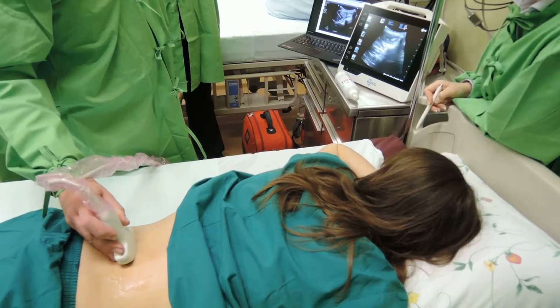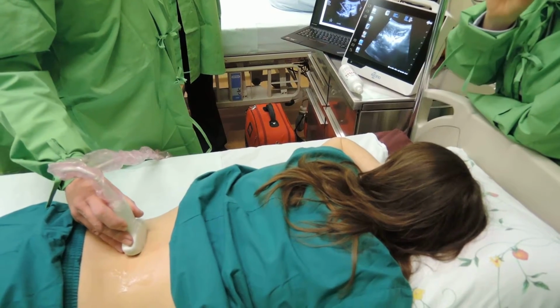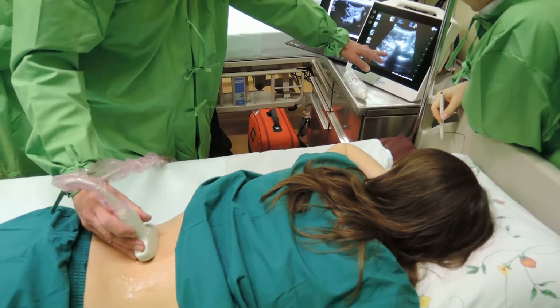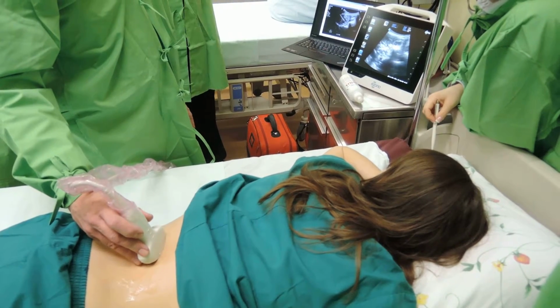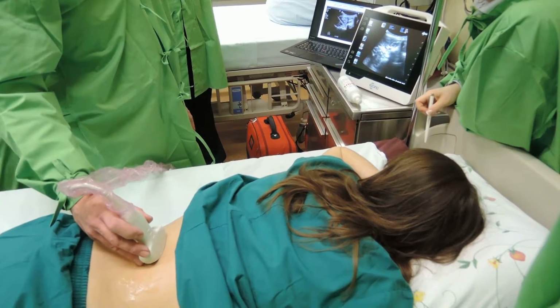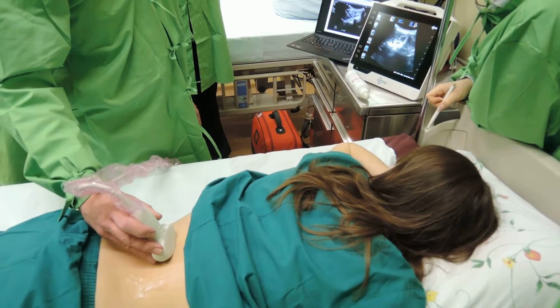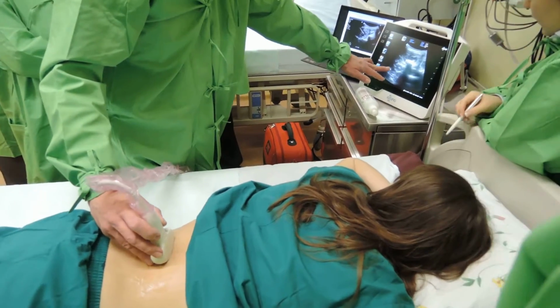This scanning we mainly use for orientation, when we find the midline and the spinous process. No, this is the articular processes. And now one can use it as well to show the origin of the nerves. Next we will try to bring out the nerves.